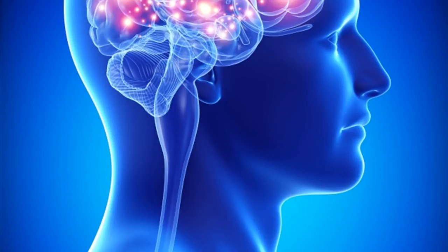For the rest of the hour, we're going to be talking about taking pictures of your brain from outside of your head. Figure out what's going on inside of your head. This field is called functional magnetic resonance imaging, or fMRI, and it lets scientists monitor the flow of blood within the human brain as it works or responds to various stimuli.